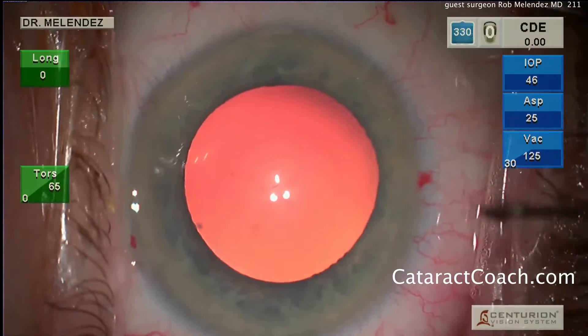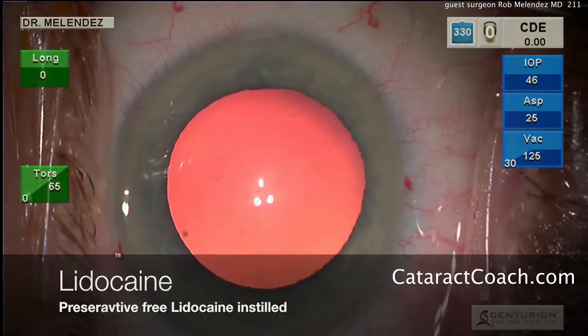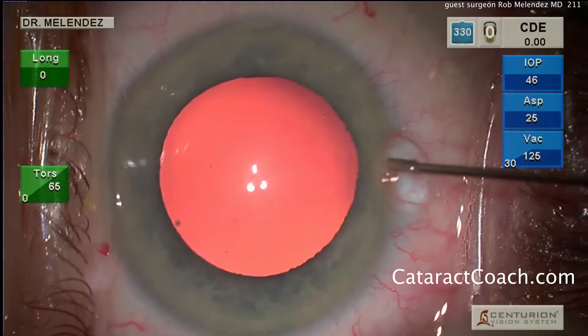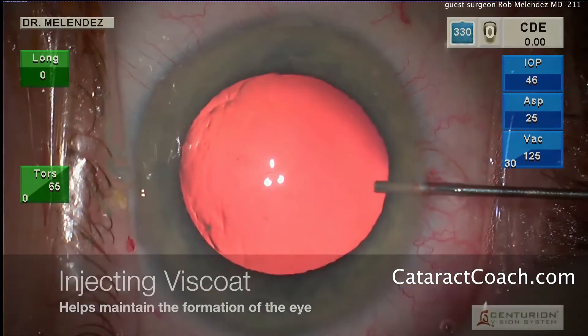He's sitting temporally — this looks like a right eye. Anesthetic is being put inside the eye; that's preservative-free lidocaine. Now he's going to put in his viscoelastic, which is Viscoat, a dispersive viscoelastic.